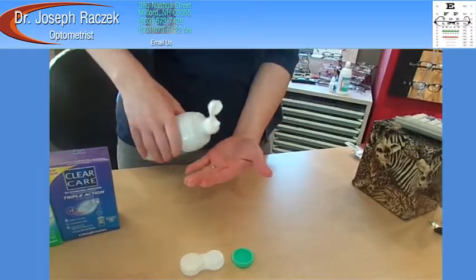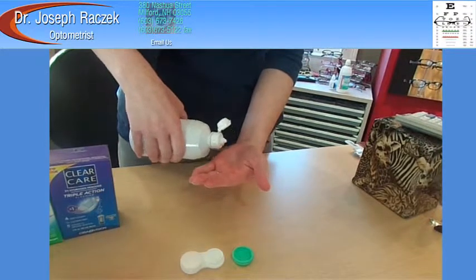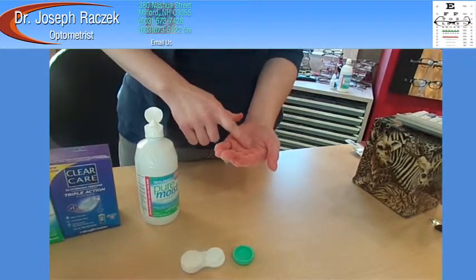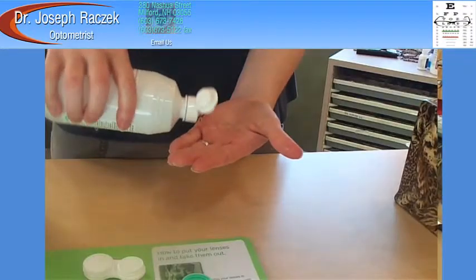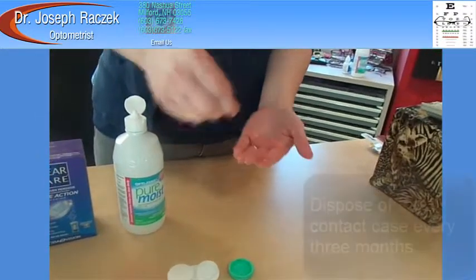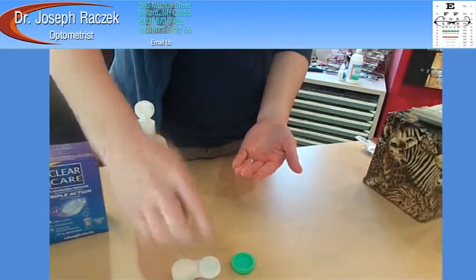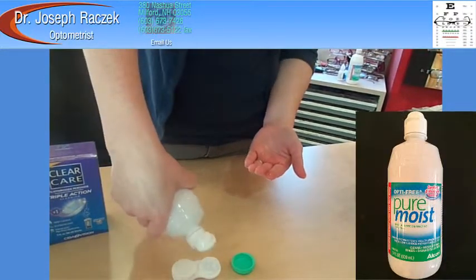These lenses are easy to take care of. You take them out after using them. You rub them in the palm of your hand with a multi-purpose disinfecting and cleaning solution. Rinse them and then place them into your clean contact lens case covered with more of the same solution. These solutions are readily available in any pharmacy or grocery store.